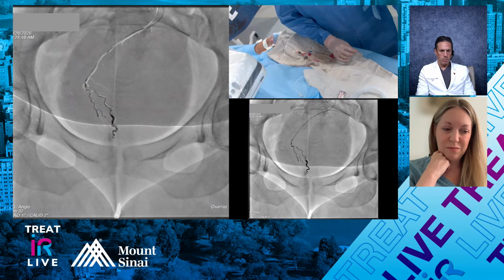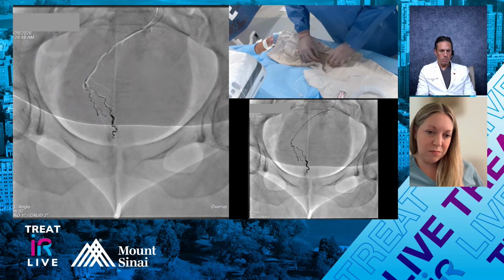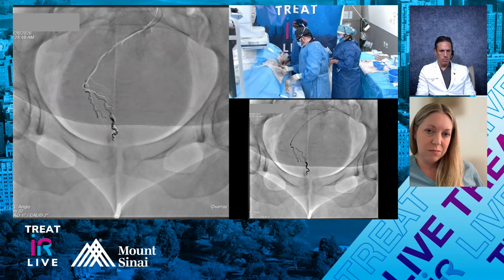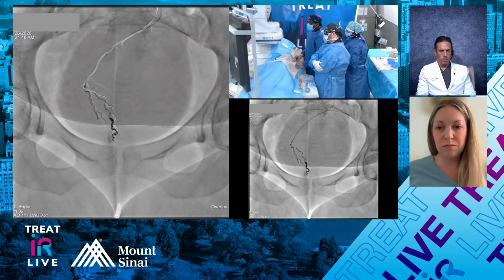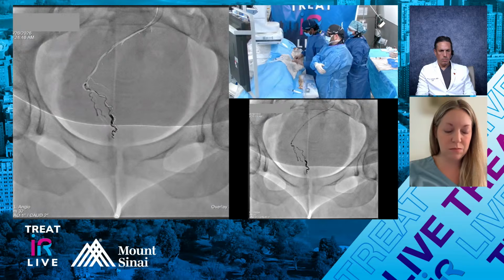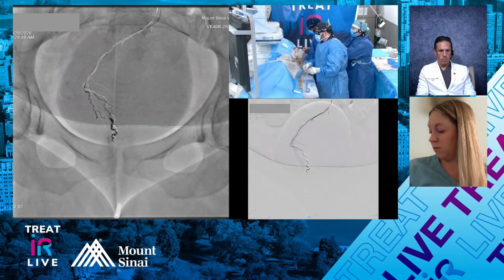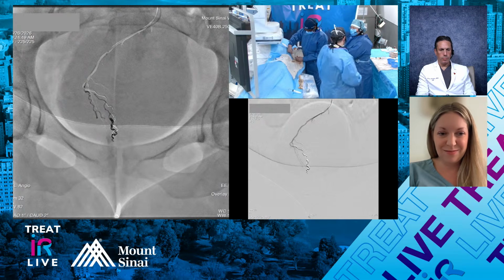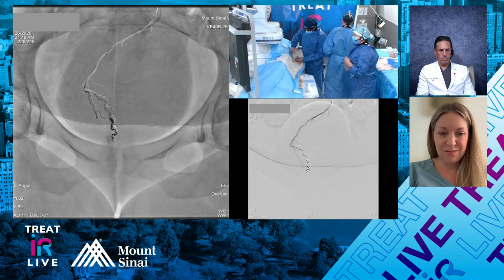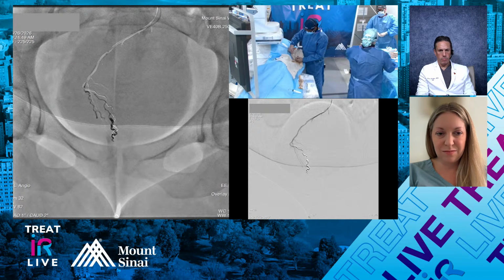Yeah, it's the Siemens Icono platform. It's the newest Siemens machine that we have. Like you said, we've been incredibly happy with the machine. We do a pretty high volume of knees here, but to be honest with you, it's the prostates that are difficult. Getting good image quality over a knee isn't really that impressive. When you're doing a prostate at 35 degrees over an American-sized male, that's really when your imaging is going to be impressive, and it does it with low doses, and it gets good image quality.